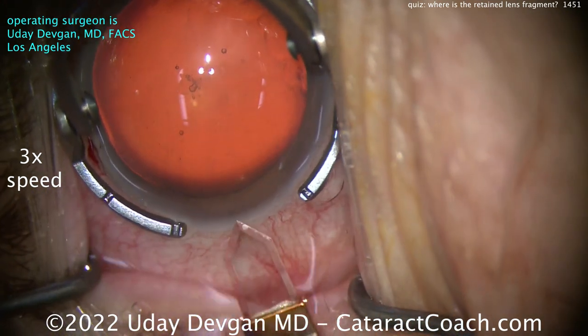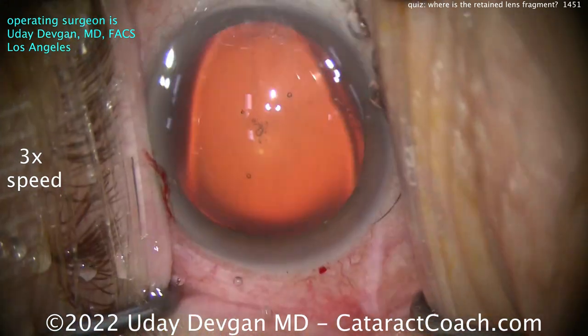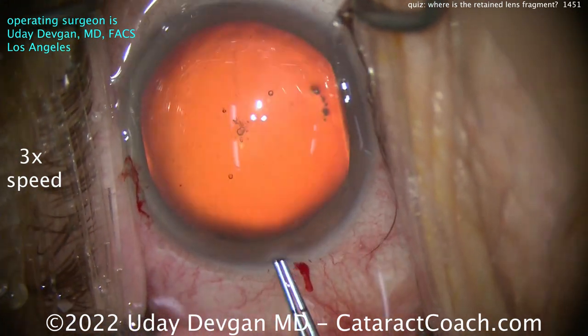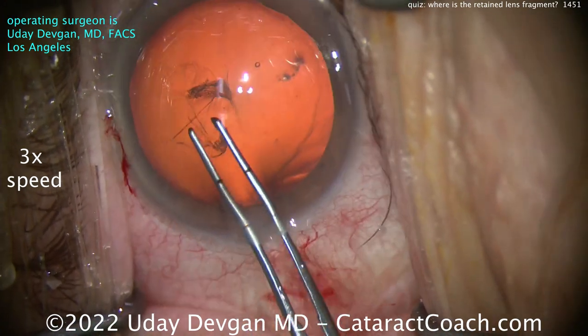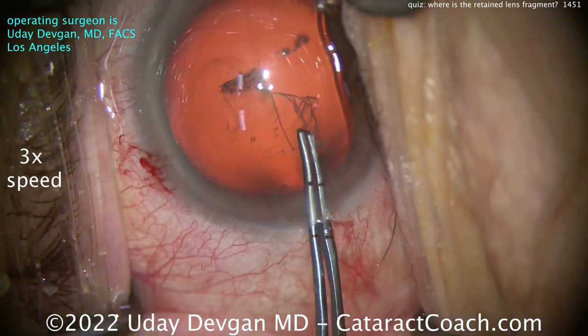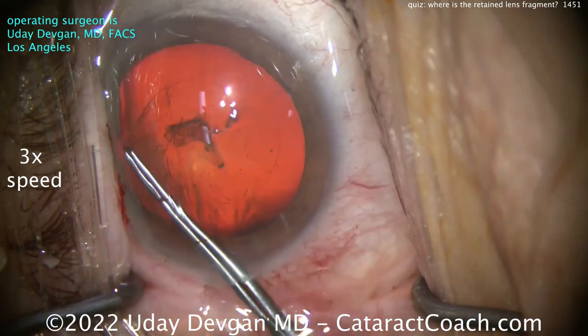We got some good viscoelastic going in, the incision's good, the rhexis will be good. Not so great though — look at that draping, those eyelashes poking out. All right, not the best draping, I will give you that. Let's continue, getting the rhexis done.